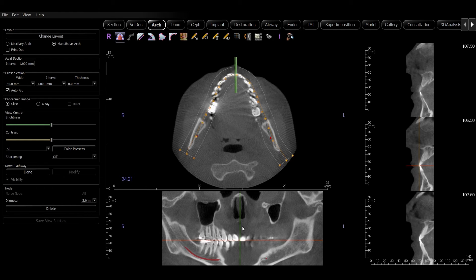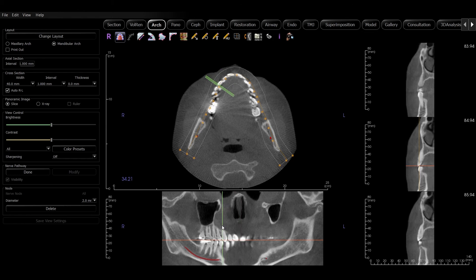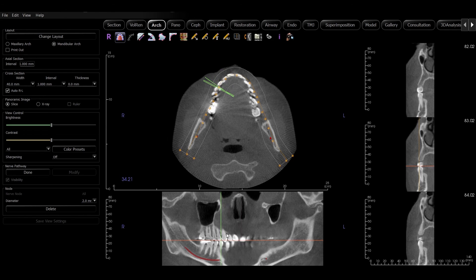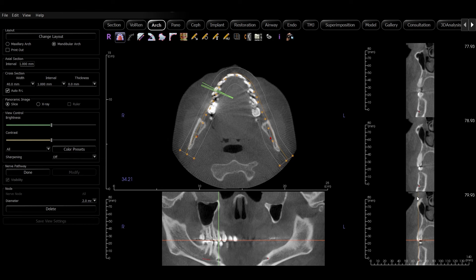Next I'll change my view using this green line by left clicking and dragging over to the end point, and I'll place an end point just outside the mandible.